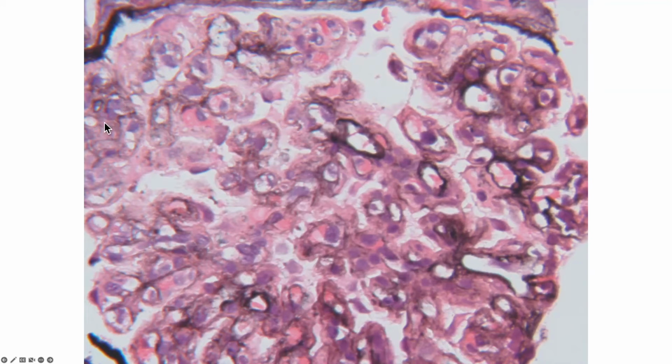See, that's mesangial. Oh yeah, you just went over it. Right there. Yeah, see, that's a lumen there. When you go down, there's a lumen. That white area is a lumen. So if you look around that periphery, it's all remodeled and thickened and multi-layered in that loop.